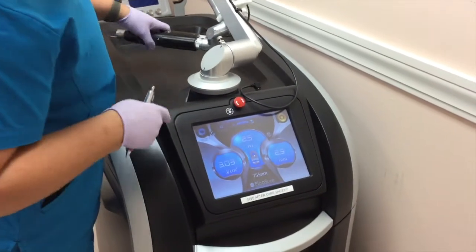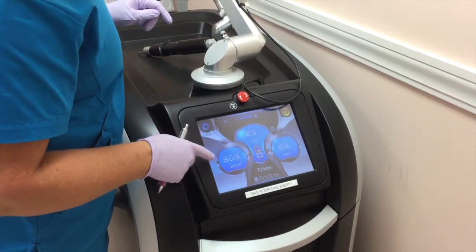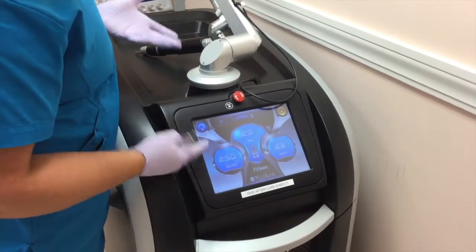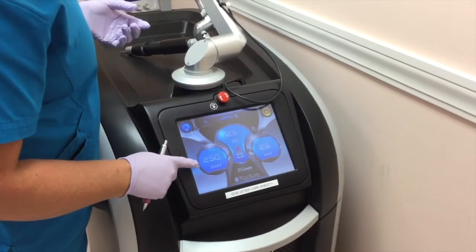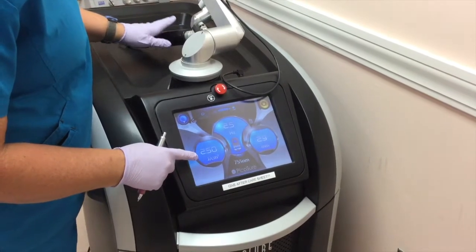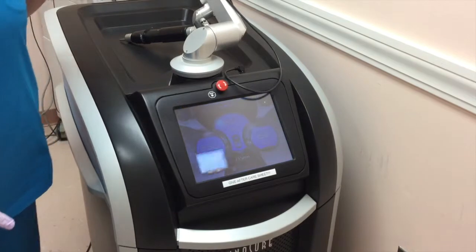I'm setting the spot size, the millimeters, and the hertz for treatment. I'm increasing the energy — it's a boost — to increase the energy that's transmitted with the laser for the treatment. So the boost will cause an even shorter pulse duration, which increases the shockwave effect on the tattooing.